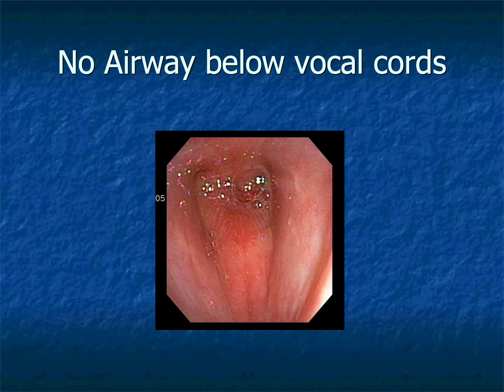These moments remind us that bronchoscopy is not purely diagnostic. Airway medicine frequently exists at the boundary between observation and intervention. Recognition must sometimes become action within seconds. Procedures can and often are life-saving.